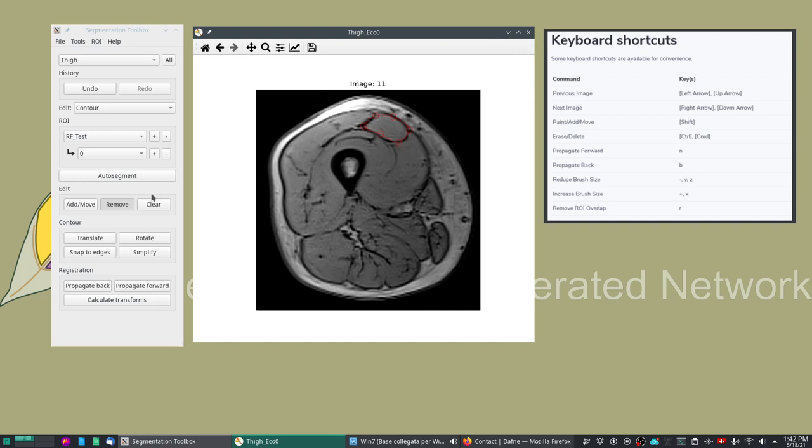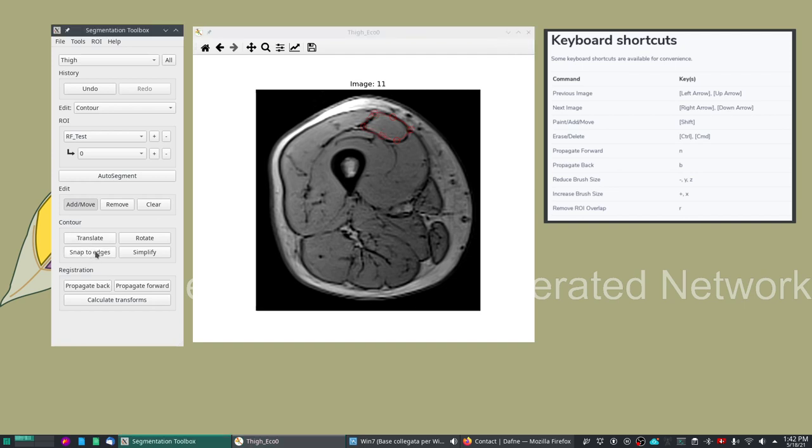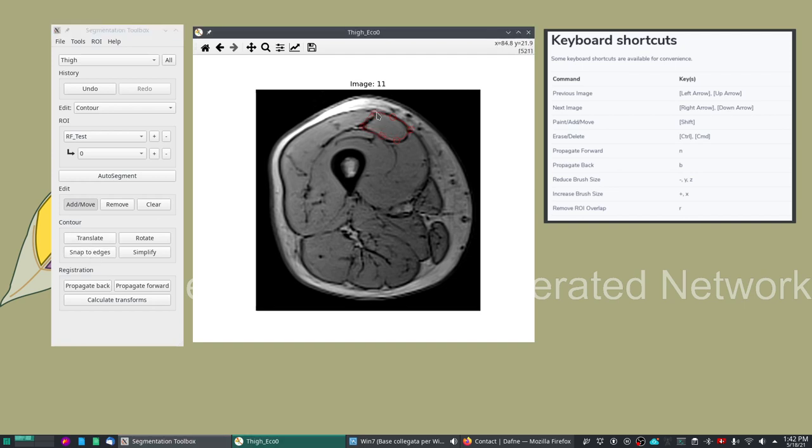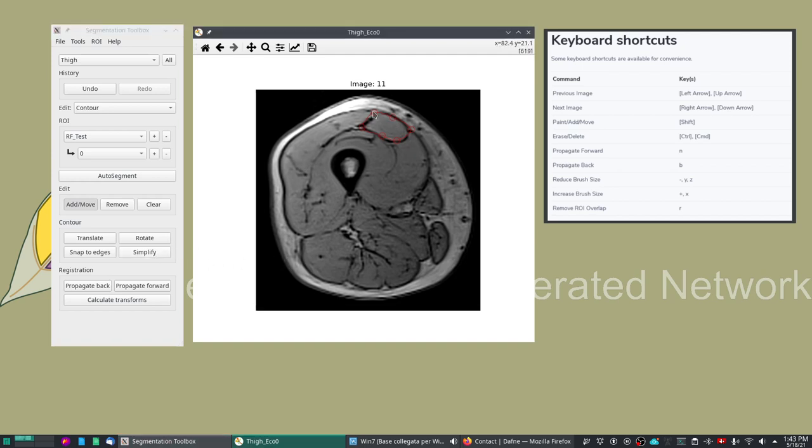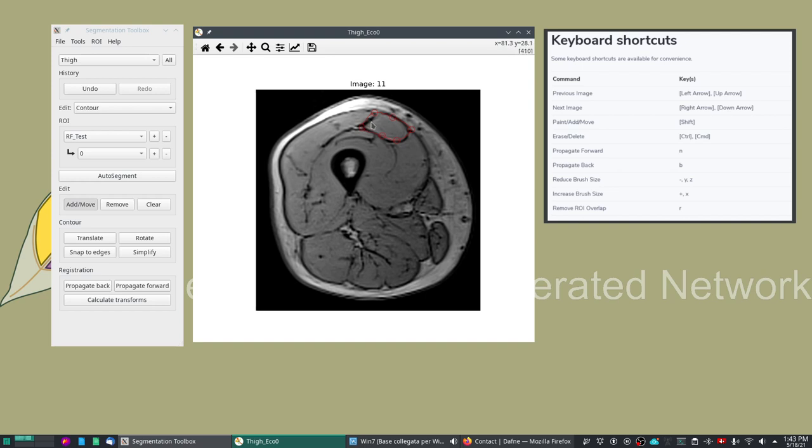The contour option has also a couple of other possibilities which is some functionality to do snapping to the edges of the feature. For example here it will try to detect the nearest edge and snap the handles on that.